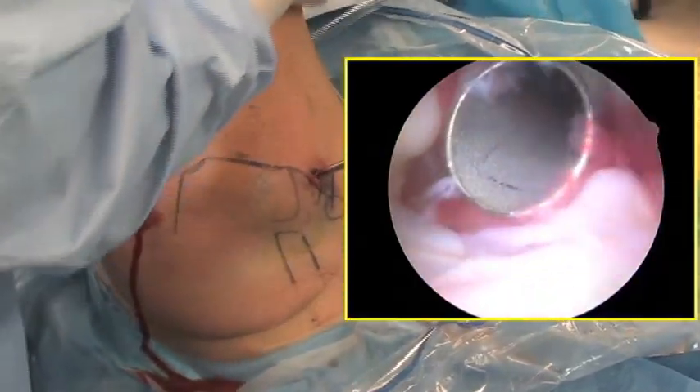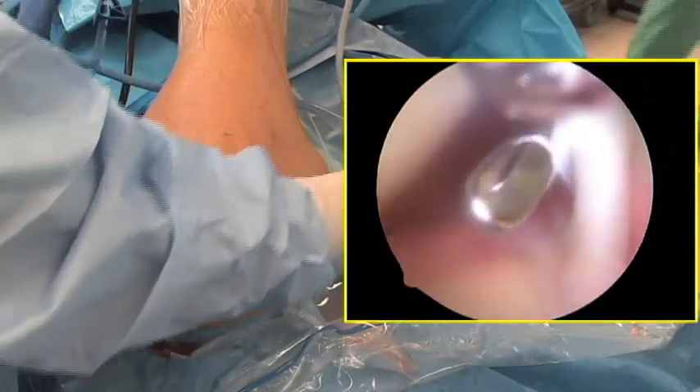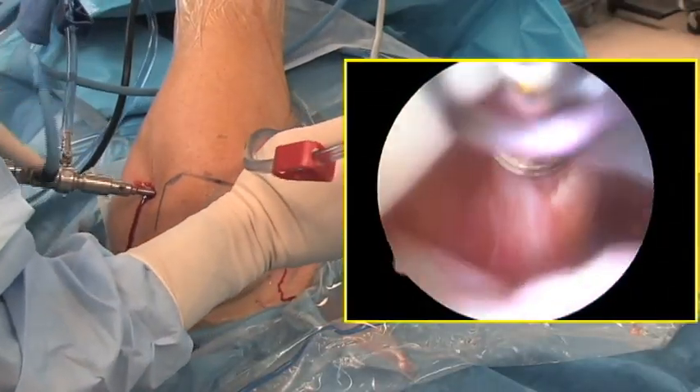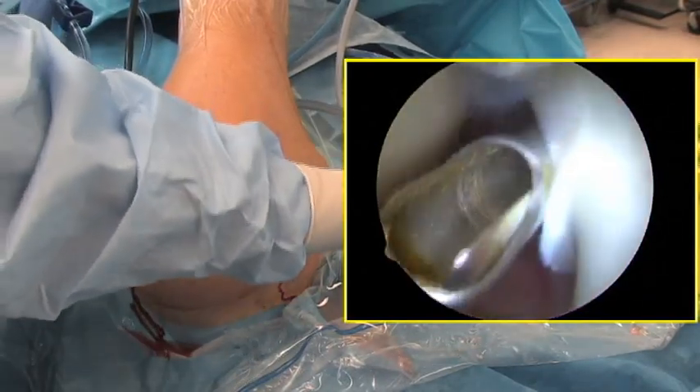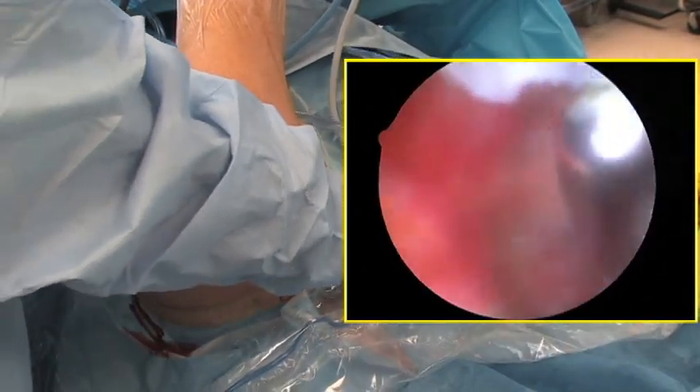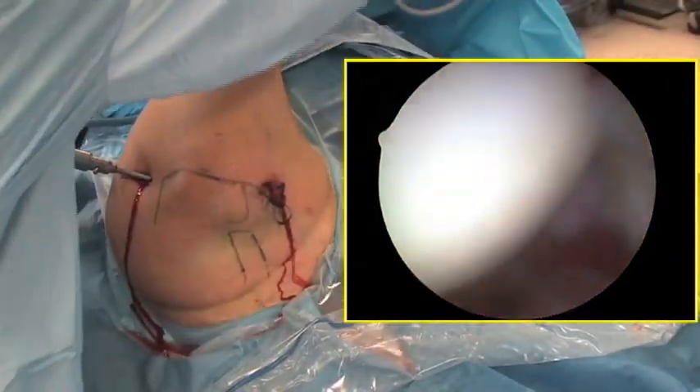An arthroscopic shaver is inserted and used as a probe. Each of the tendons of the rotator cuff are inspected, starting with the subscapularis, which is intact. The undersurface of the supraspinatus is inspected and can be debrided with the arthroscopic shaver. In this patient, there is a full thickness tear of the supraspinatus tendon.